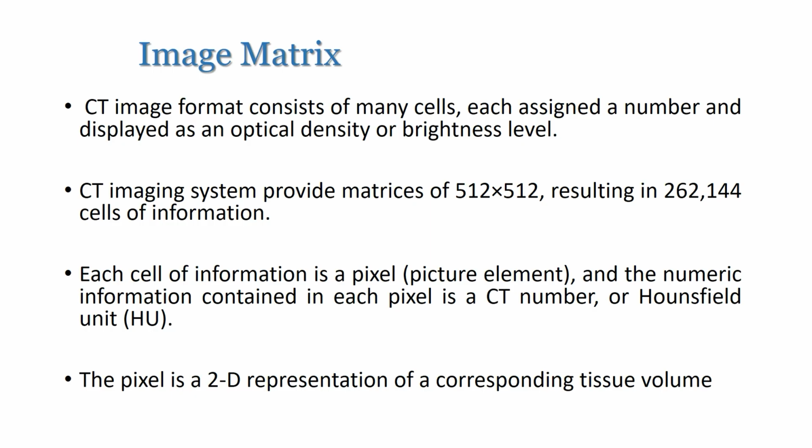After discussing this CT unit, we will discuss the image matrix. The CT image format consists of many cells, each assigned a number and displayed as an optical density or brightness level.